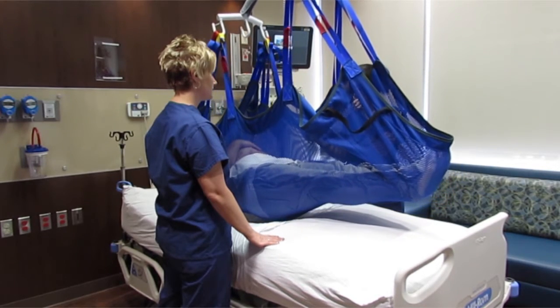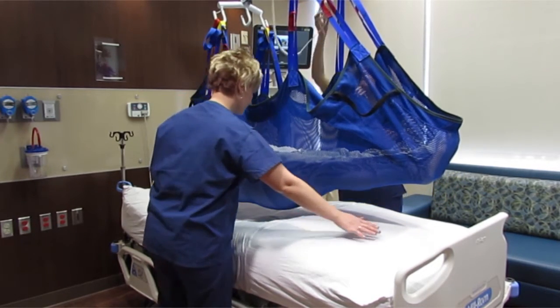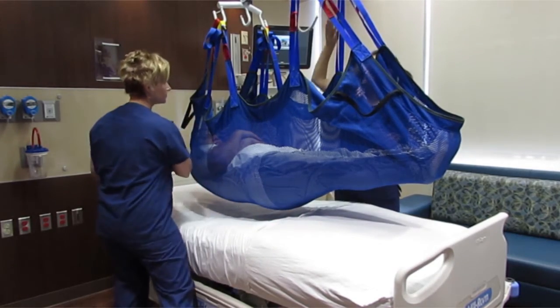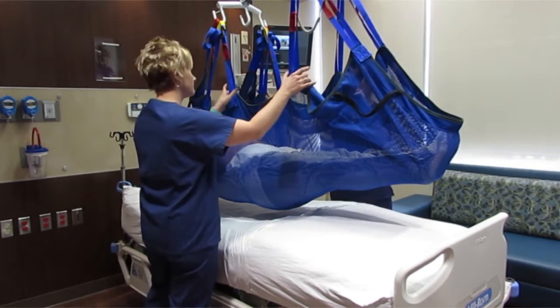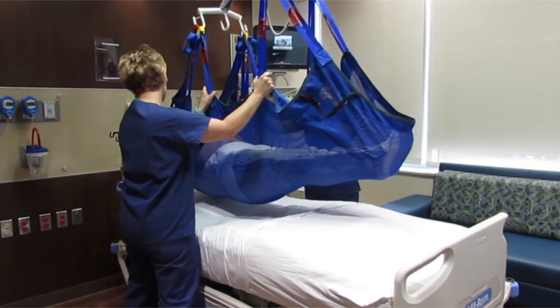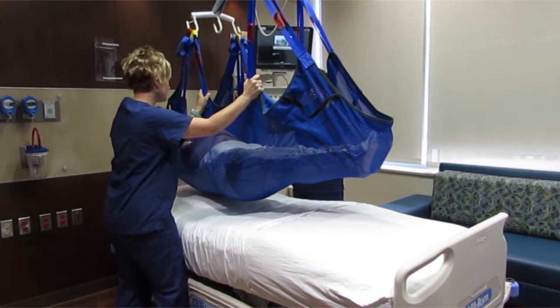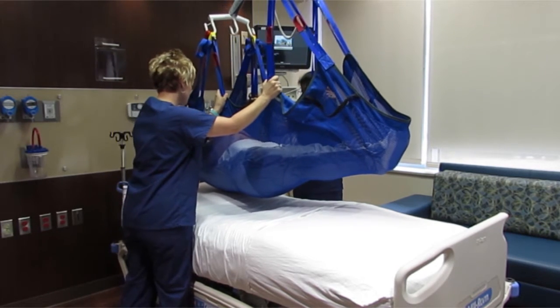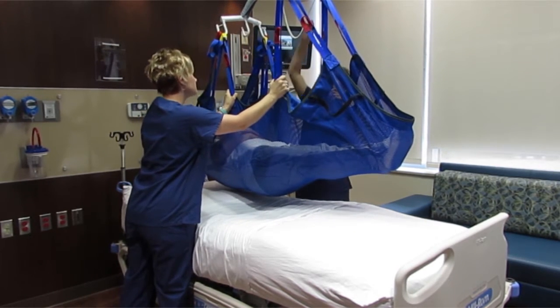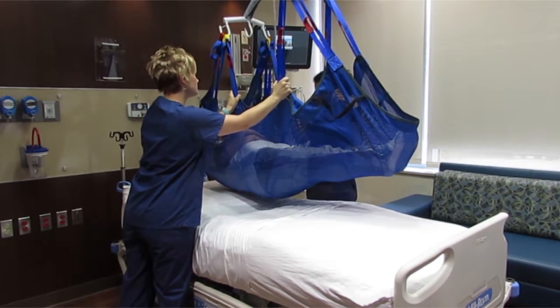Once cleared, continue raising the patient up just enough to clear the surface. To reposition the patient up in bed, simply bring the patient towards the head of the bed. If the patient needs to be offloaded to one side, you may need to bring the patient slightly over to one side of the bed to allow room for the log roll.